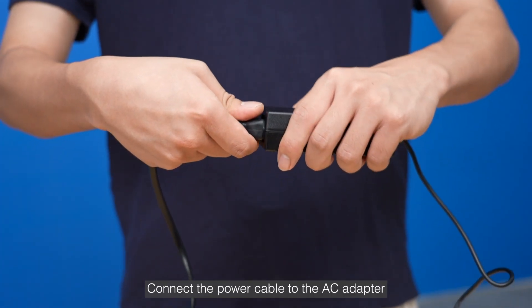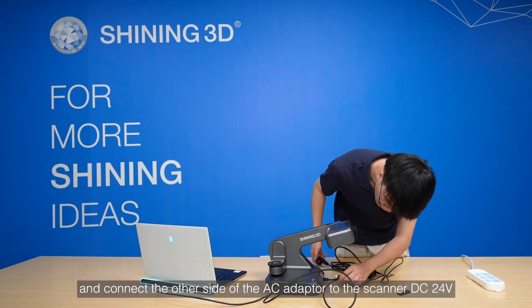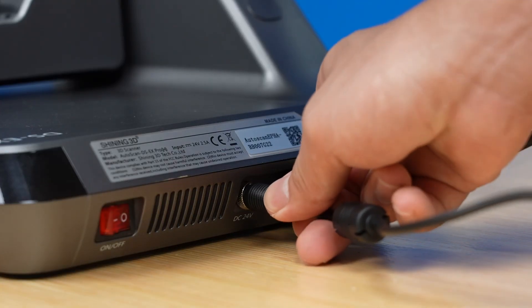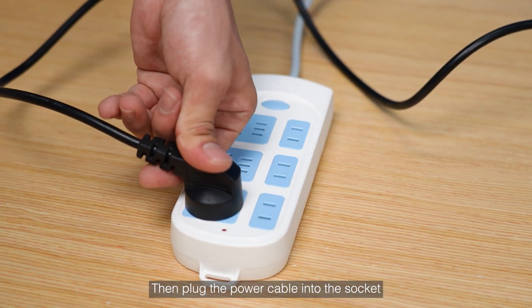Connect the power cable to the AC adapter, and connect the other side of the AC adapter to the scanner DC 24 volts. Then plug the power cable into the socket.